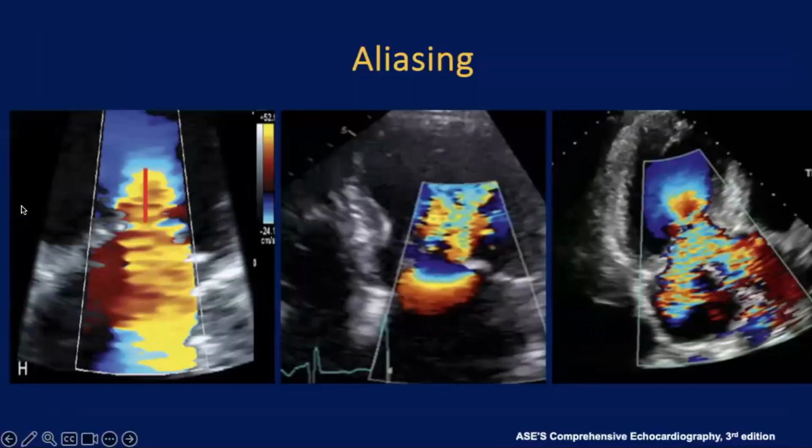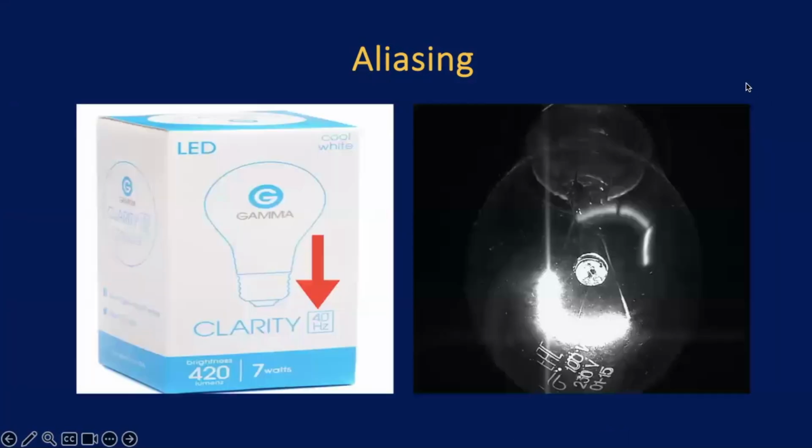As I told you, we can use it to calculate, for example, for the valve, regurgitant orifice, regurgitant volume, and regurgitant fraction. You can detect if there is stenosis just with aliasing. You can know that there is significant stenosis, a significant leak, a PFO, an ASD, or SAM. So always be happy to have this aliasing.